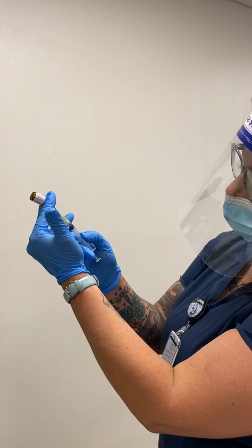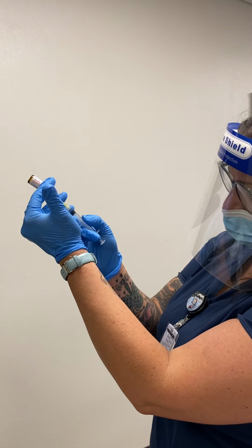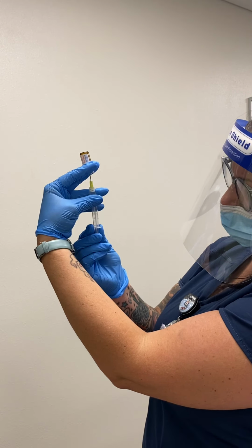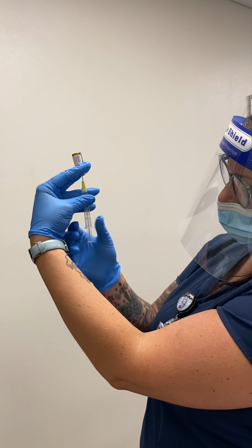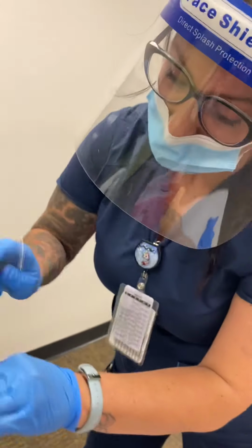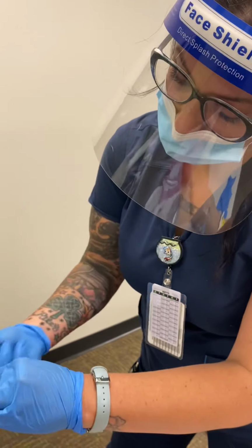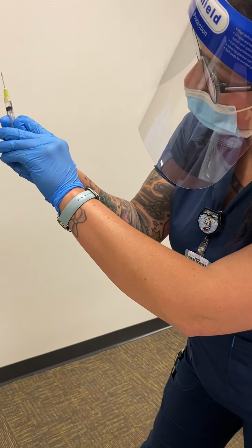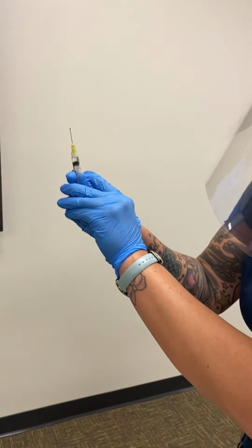I'm going to get a little bit more so that I can make sure there's no air bubbles. Okay, so that's good.